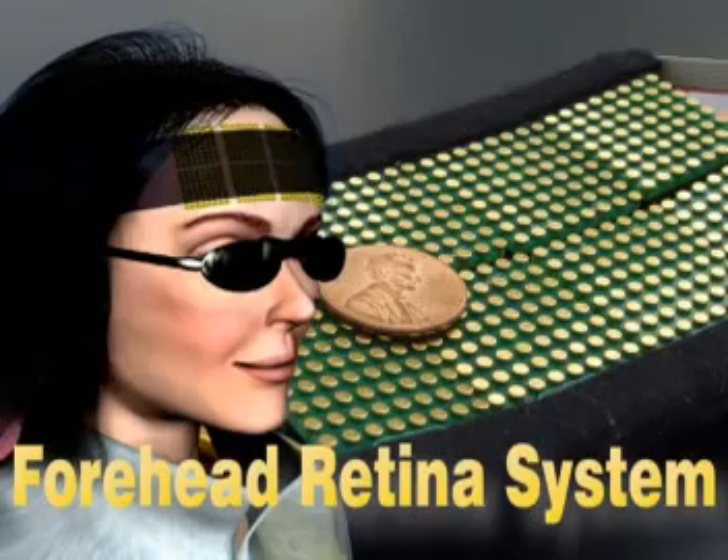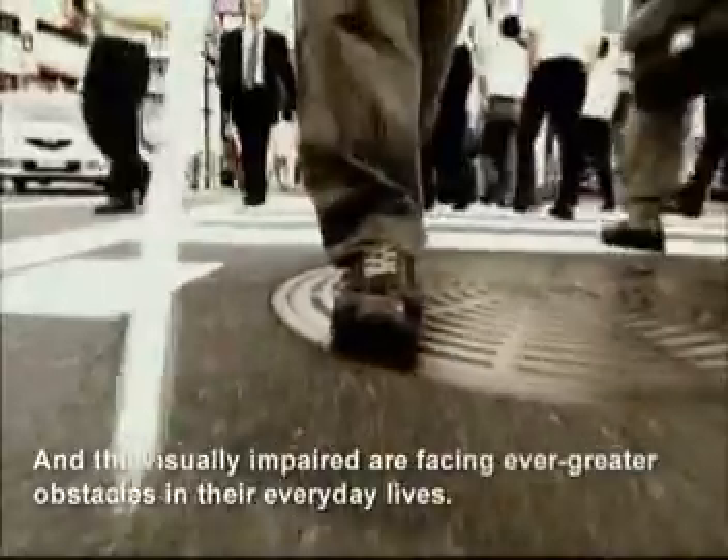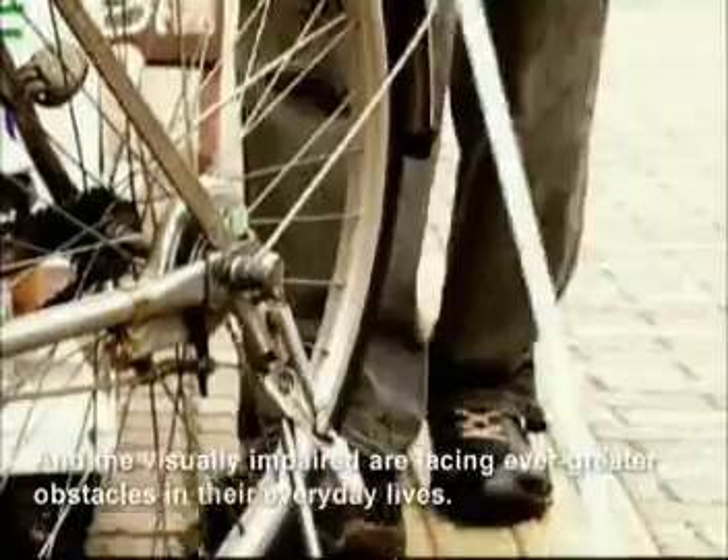A forehead-retina system. In our information-intensive society, the amount of visual information is increasing rapidly, and the visually impaired are facing ever-greater obstacles in their everyday lives.